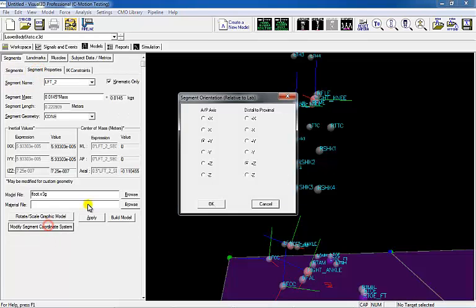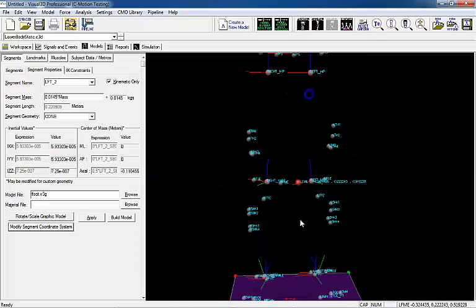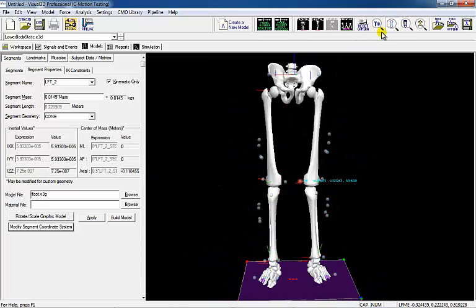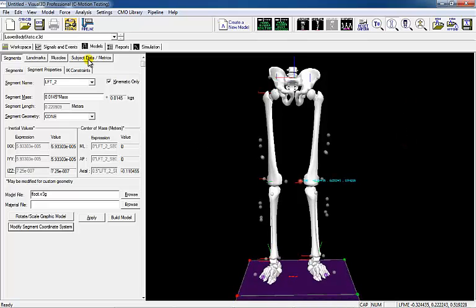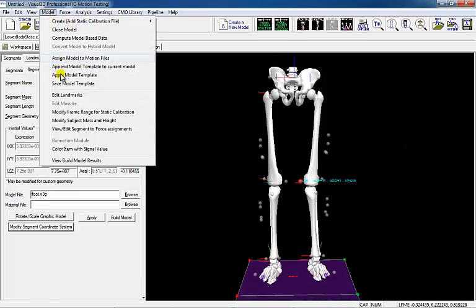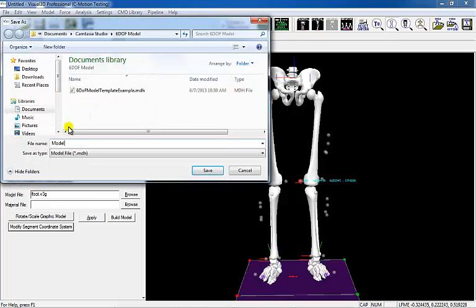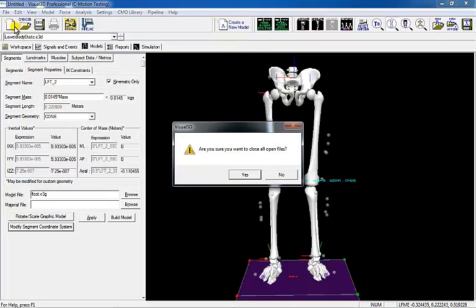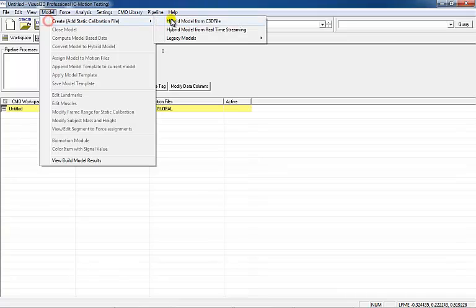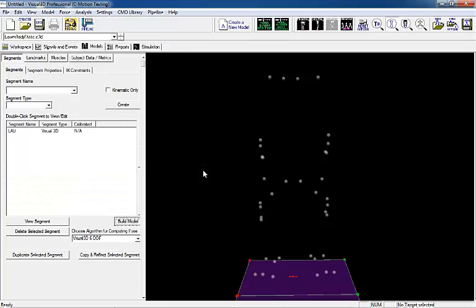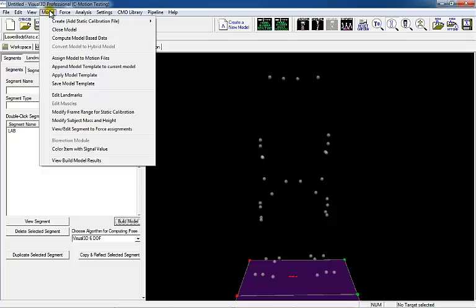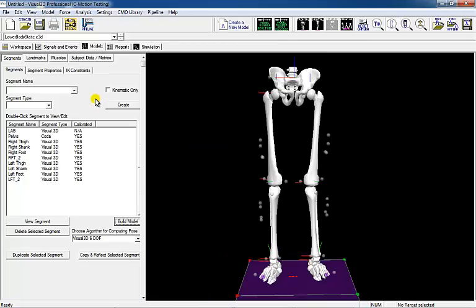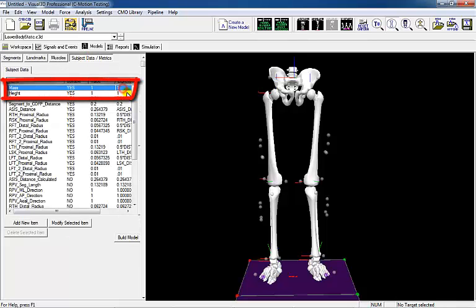So the segment coordinate system of the kinematic foot is consistent with the knee and hip coordinate systems, the kinematic foot coordinate system must be modified. Once the segments have been identified, the model file can be saved and applied to future files. Clear the workspace by pressing File New. Open the static C3D file and apply the model template. Make sure to change any subject-specific measures in the model template, such as subject height and weight.